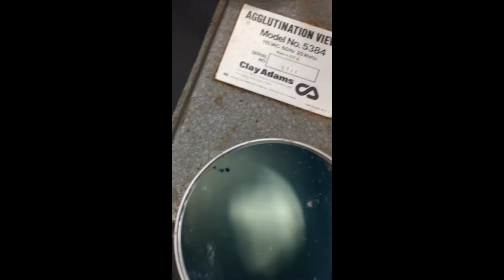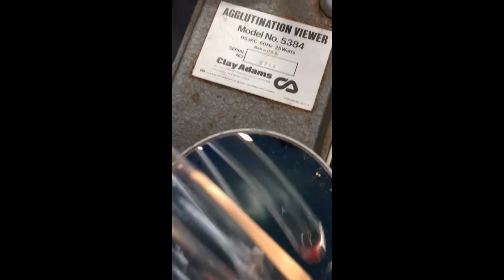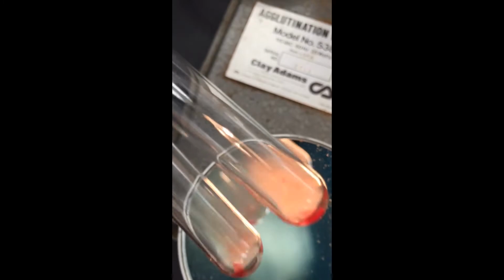Tubes 5 and 6, this is sample C, immediate spin. There it goes. Seven, 8.